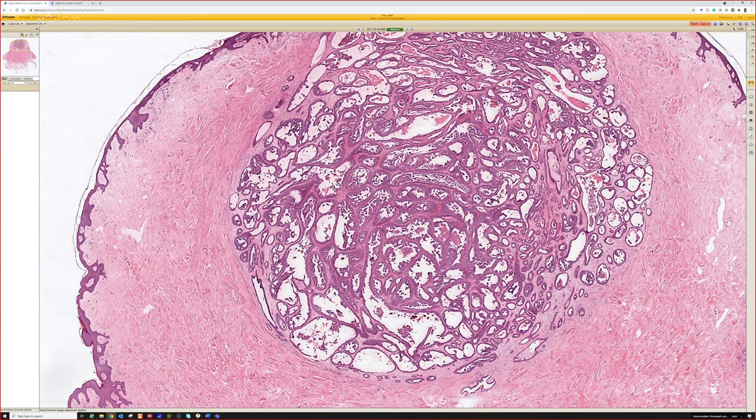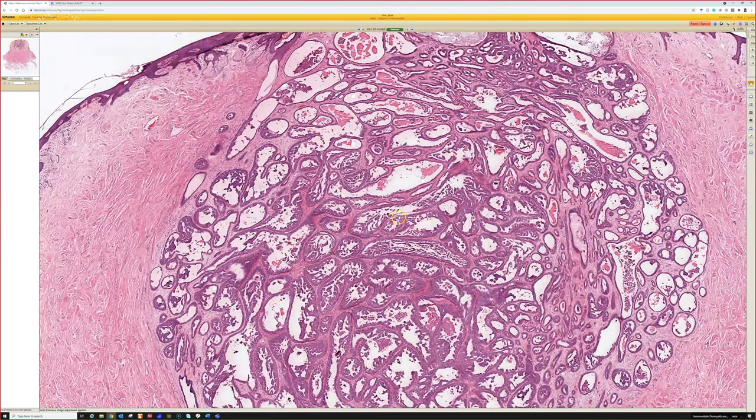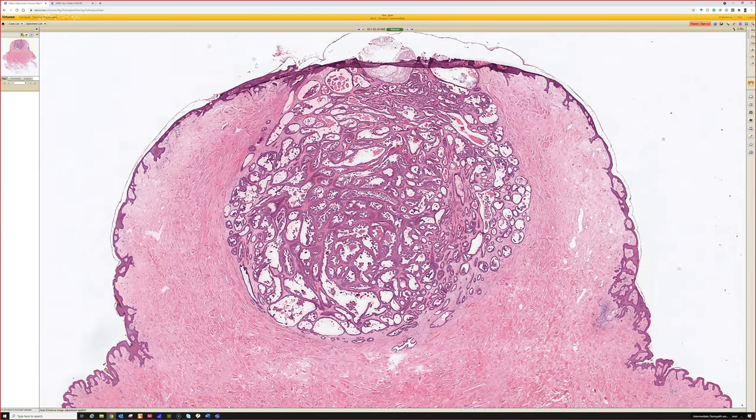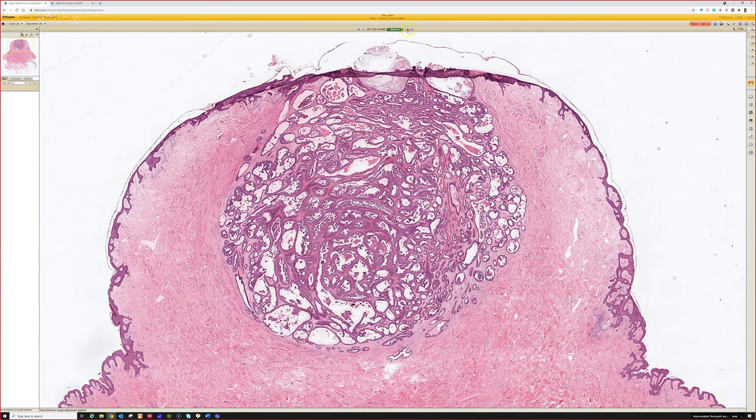When we see a partial biopsy, there's always the possibility that maybe it is actually a ductal papilloma deeper down in the nipple duct and that it's just pushing up and getting superficially sampled. And my understanding is that ductal papillomas in the breast usually get completely removed because occasionally they can have cancer arise in them. So again, I don't know a lot about breast pathology, but in that setting, I usually do recommend that the dermatologist consult with a breast surgeon just to make sure they've done an exam to see if there's anything deeper or if it really is limited to the skin, so that they can decide how to best manage the case. So this is really a perfect textbook example, I think, of nipple papilloma. And they often ulcerate, and that's why they get called erosive adenomatosis as their other name.